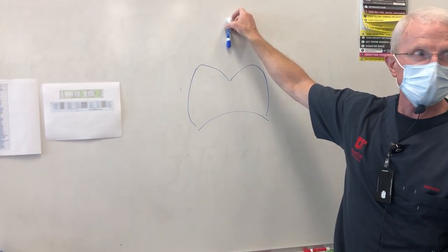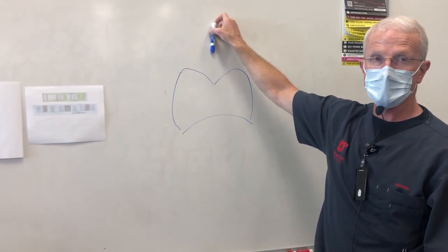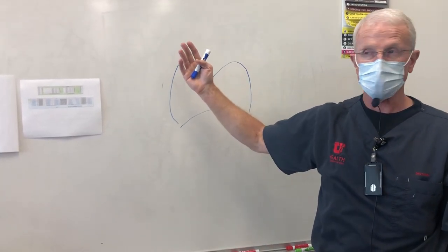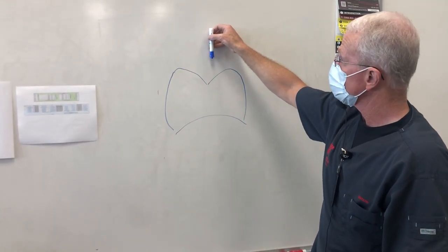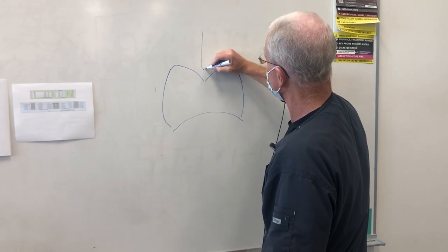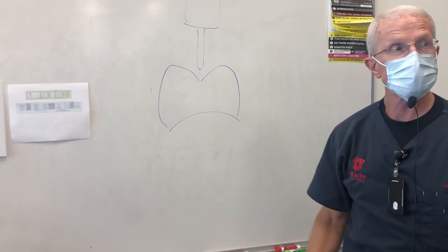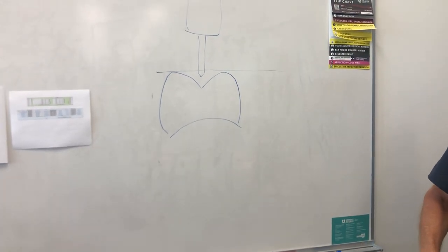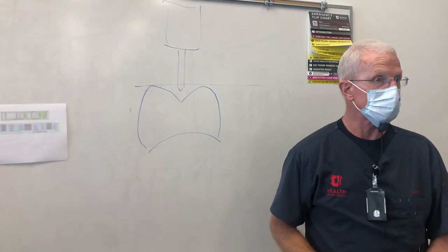Line up with simply the axis of the second molar behind it, because it's very similar, if not identical, to the tooth you're preparing. Now, on the tooth you're preparing, you've already cut the occlusal surface down, you've done your occlusal reduction, but you haven't on the tooth behind it. So when you start your preparation, just take the handpiece and set it right here, and line up with your visual axis. It's going to be just about perpendicular. If you were to draw a line cusp tip to cusp tip, your burr will be perpendicular to that.